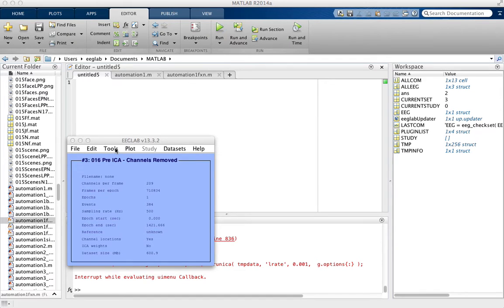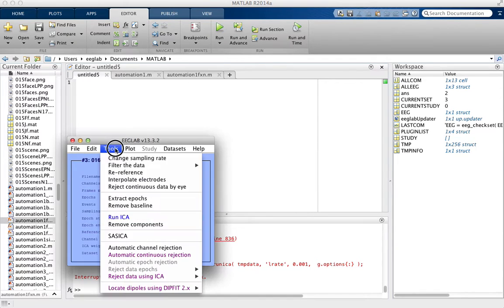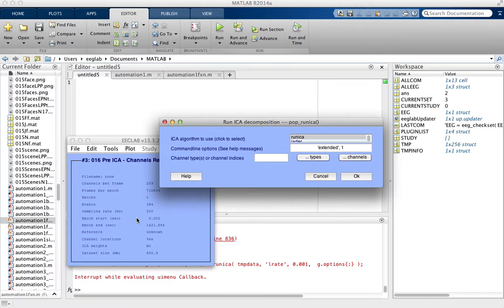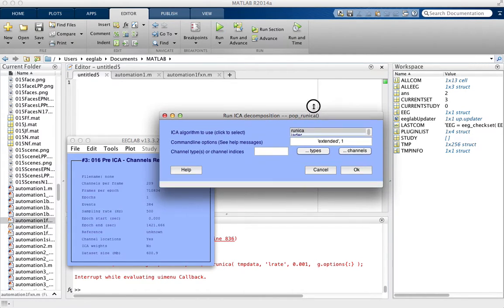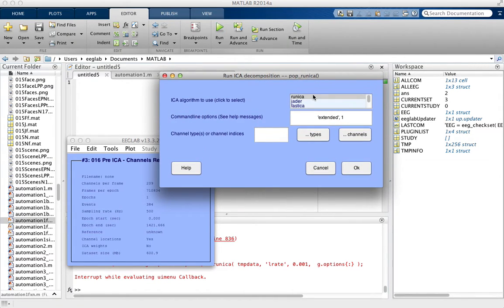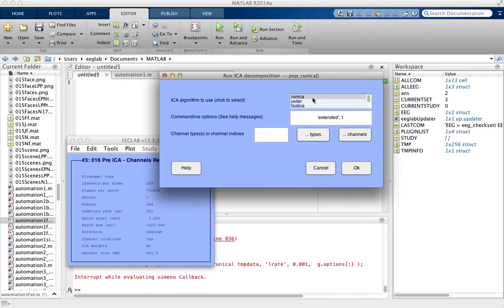To actually run ICA, click Tools, run ICA, and you get this menu here. As you can see, there are different ICA algorithms that you can run in this menu.